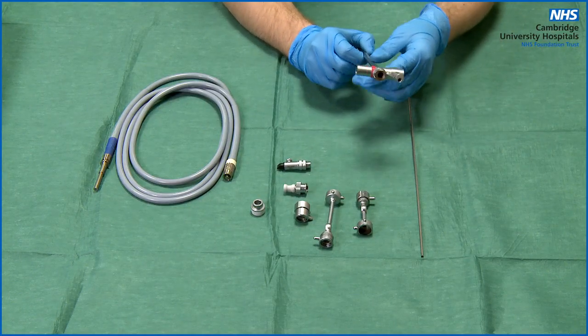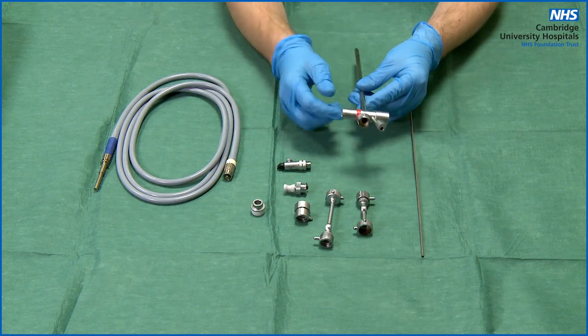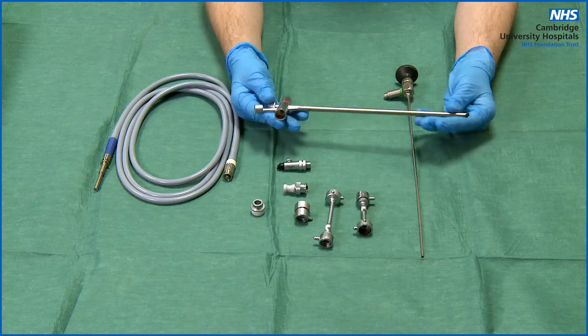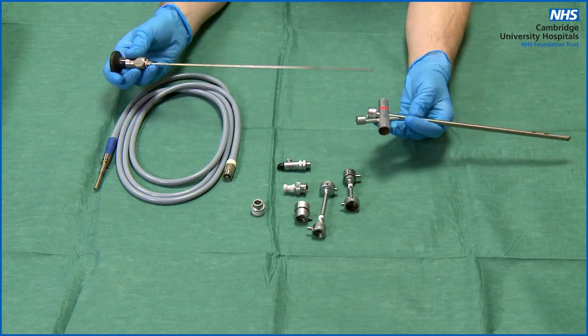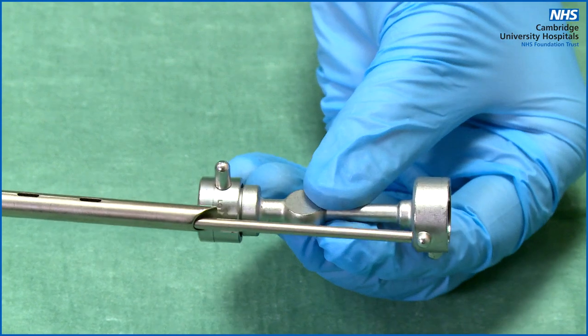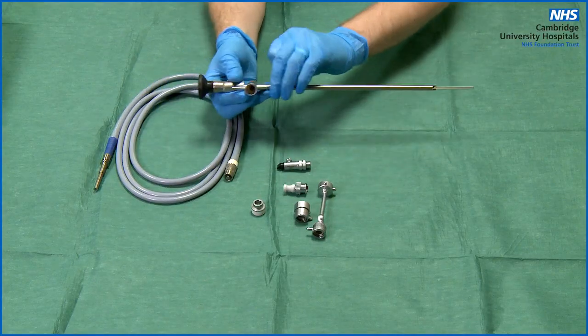The first thing you will need to do is determine which size bridge your size 4 bronchoscope will need to connect up your zero degree telescope. Without the correct size bridge, your telescope will be either too long — which could damage the telescope and injure the patient — or too short, disrupting your view. Simply hold the bridge alongside the scope and telescope and it should be obvious if it is too long or too short.